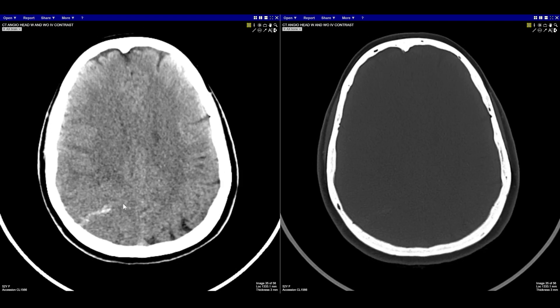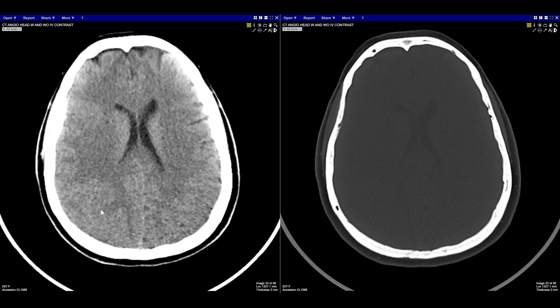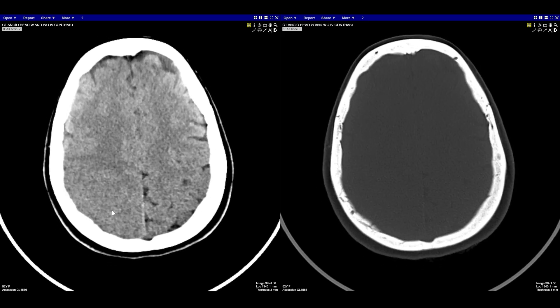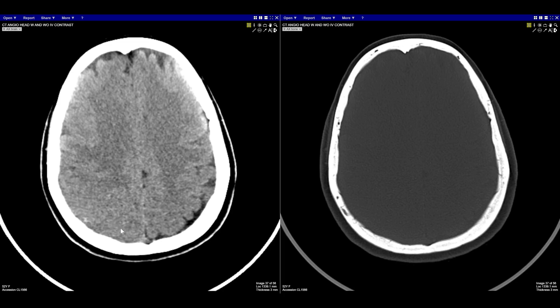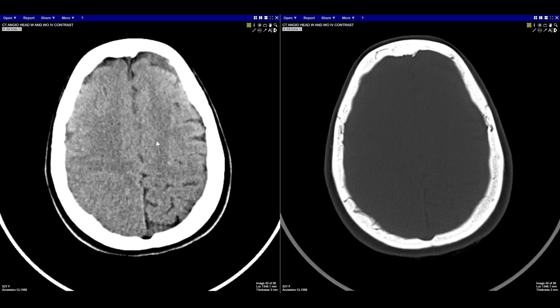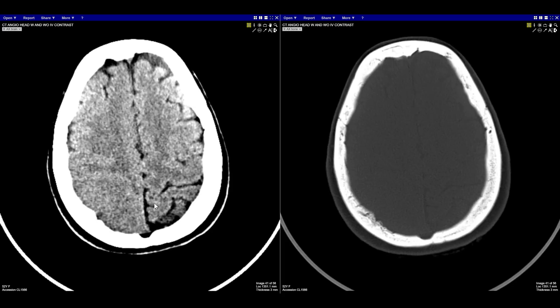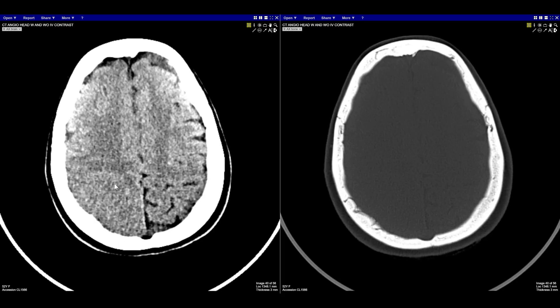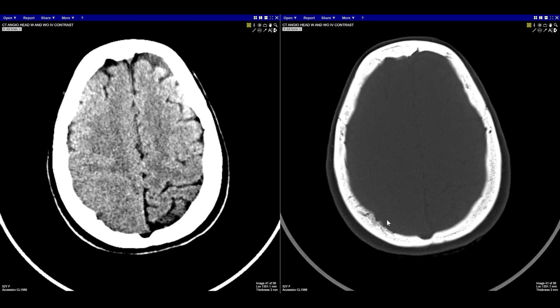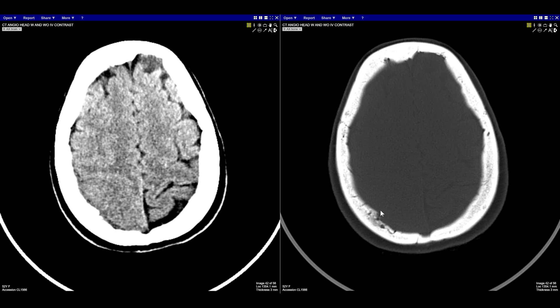Getting a little bit higher, we see what looks like some calcification and a very subtle loss of the sulci on the right — the sulcation pattern is decreased. If we window this a little bit, there may be a rounded mass up here. We're not really sure, but it definitely looks swollen. You see the sulci on the left but not on the right, so this is a problem we want to evaluate with MRI. On the bone window, it looks like there's a little too much bone — some erosion and some abnormal-looking bone there.